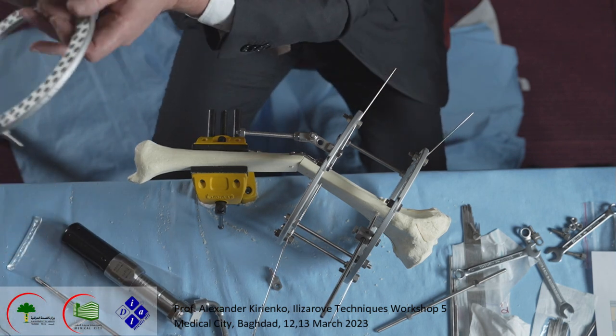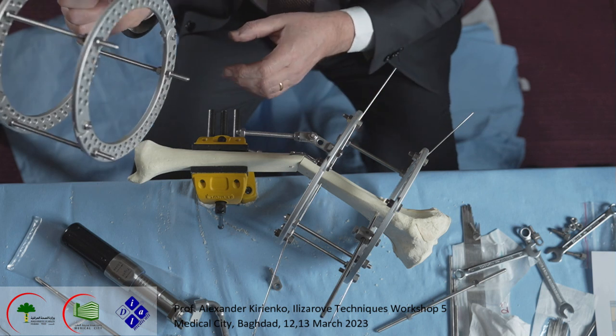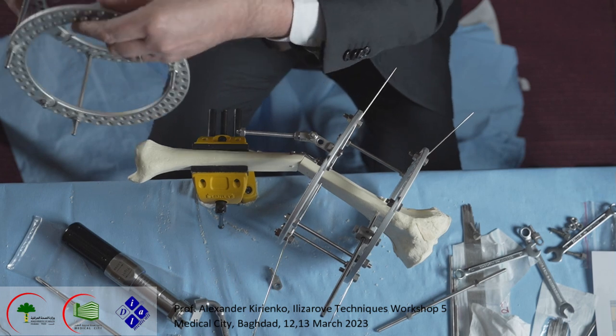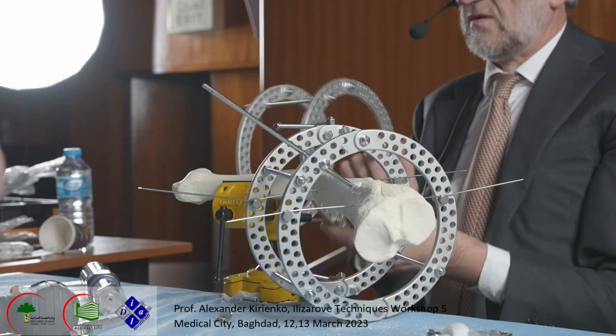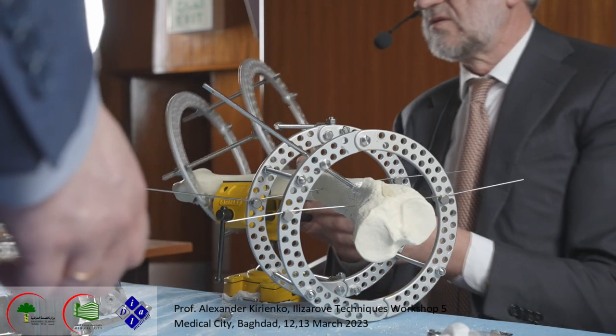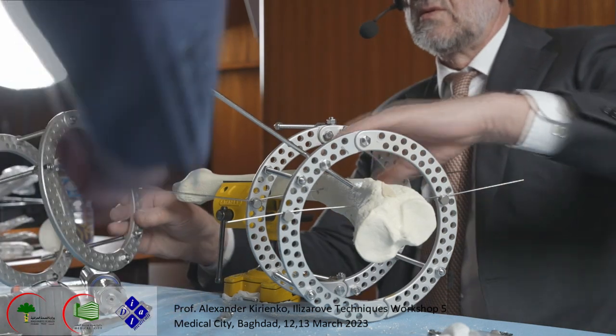After that, what we take, we create another system, 2 rings again, distal rings. Now only one problem, that here we have this. We need to do like this, maybe like this. But before doing this, we attach it.